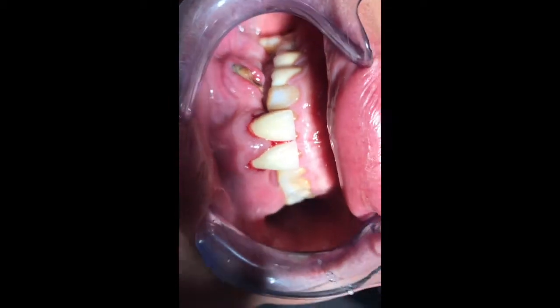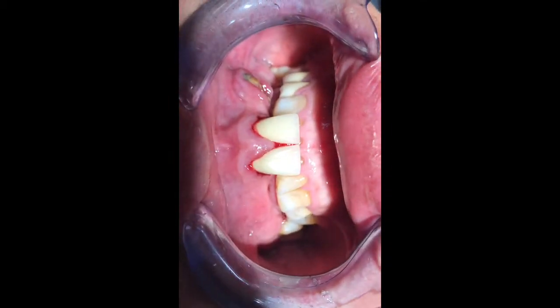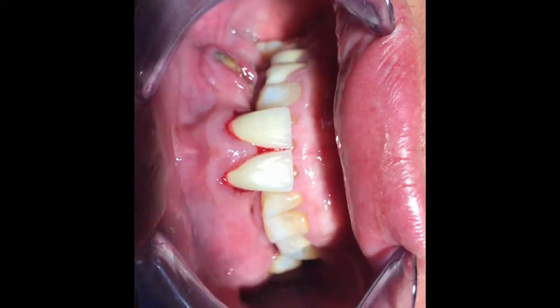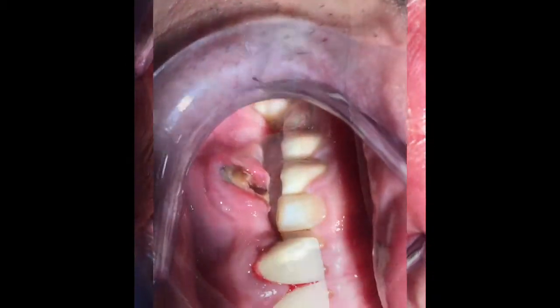However, if you remove the tooth and don't put it back in, the patient cannot go to work. The patient doesn't have a backup denture, so it's time for you to be hands-on.